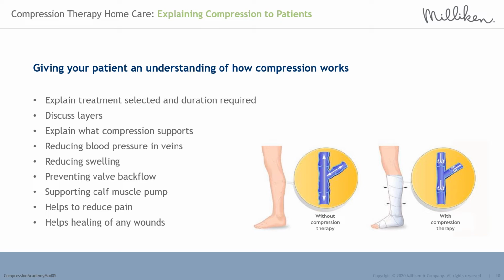Explain that we will prescribe the correct level of compression and the best mode of delivery for them as an individual. We are going to explore different modes of delivery shortly. Explain how applied compression will support their venous blood to return to the heart and by doing so relieve the symptoms they are currently experiencing.